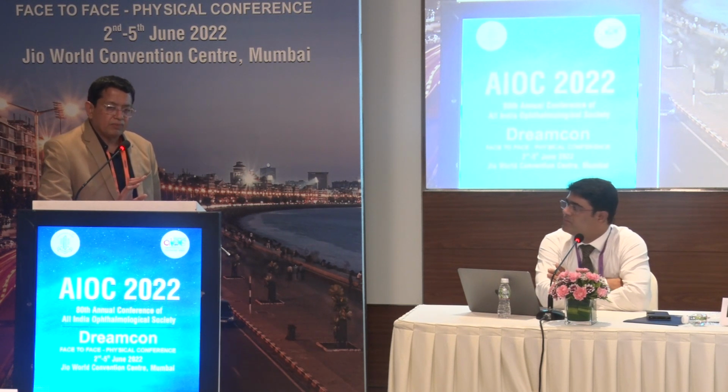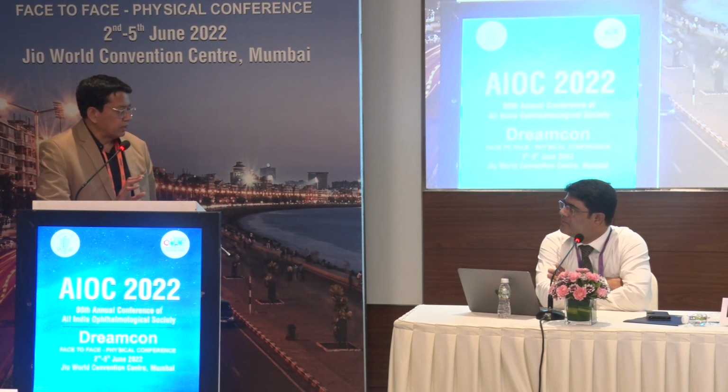I have done live surgery in different centers. Each center uses a different kind of marking. They are comfortable with that. Whatever you have mastered, whatever you are comfortable with, I think that's the way to go. But of course, if you can afford it and you have access to it, nothing like a digital marker.